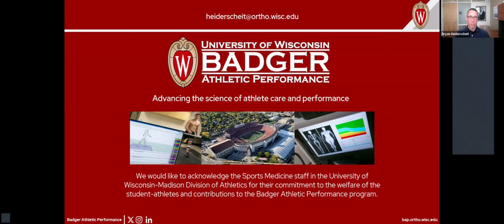But again, it doesn't necessarily need to be someone highly trained in it. The clinician, I think, should be doing the special test, because that probably takes a little more of the nuances in assessing the ankle laxity or displacement. Once the machine and the ultrasound settings are all dialed in, then it's just a matter of holding the probe in a consistent position. So a medical assistant or another individual from clinic practice can assist in holding that probe steady throughout the movement.